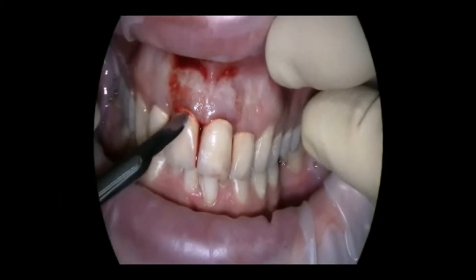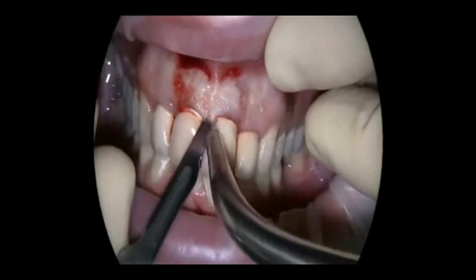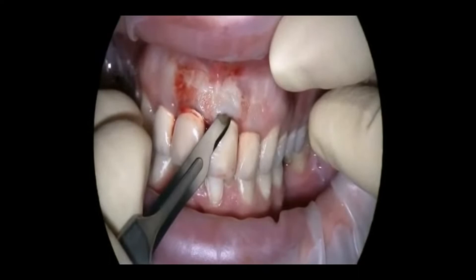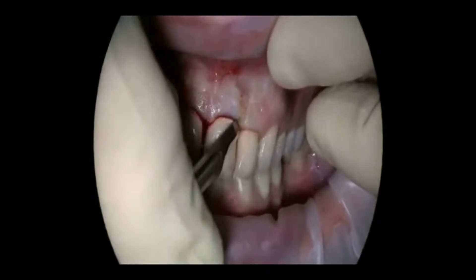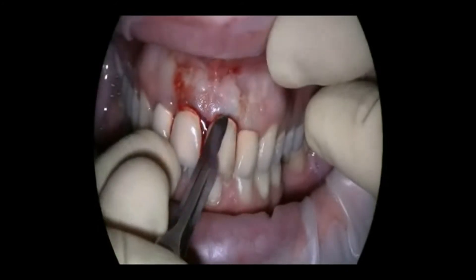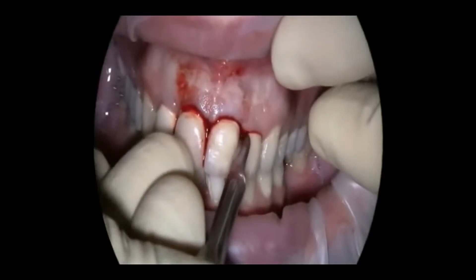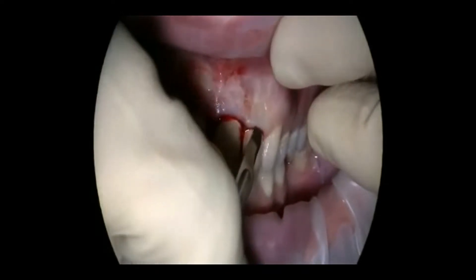The patient has frontal teeth crowns. After a few years, he developed infections at the root tip caused by bad root treatment. In the past, a root tip resection without orthograde or retrograde filling was performed. Today is a repeat root tip resection with retrograde filling. Only this will seal the canal tightly.